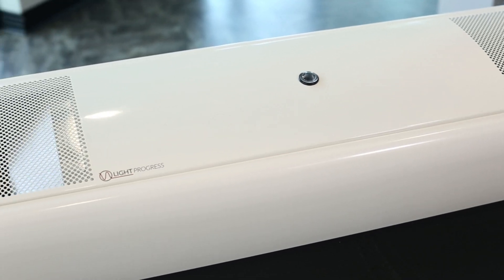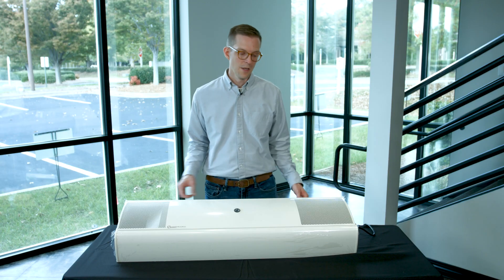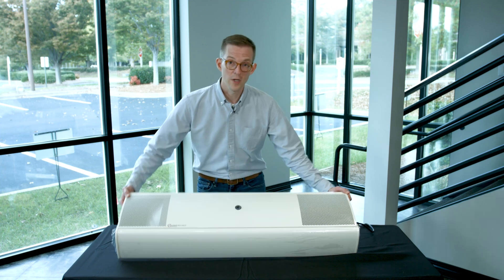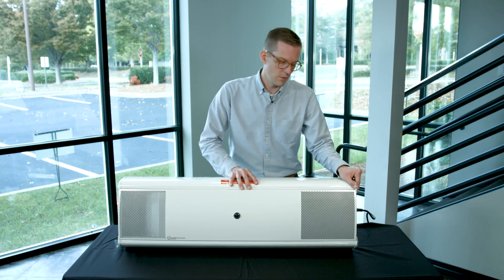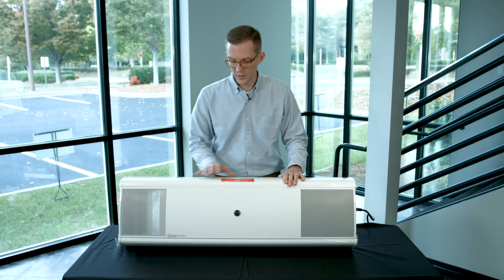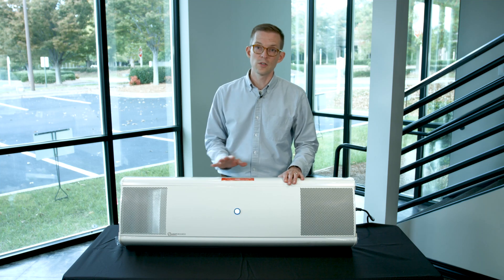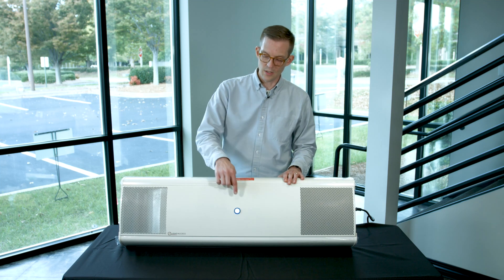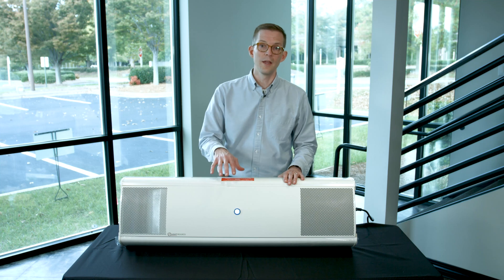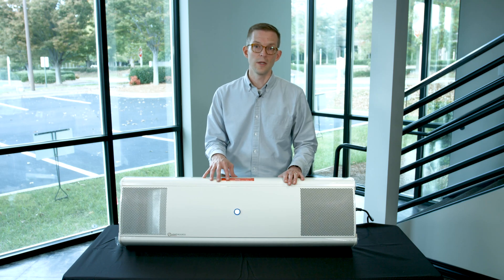At this point we've installed the UV lamps in the center of the unit and plugged it in. I'd like to go ahead and show it to you in operation. I'll pull the unit up so you have a better view and turn on the power switch. When you energize the unit, the fan starts circulating air and you can see the blue light through the sight glass in the center, which gives you an indication that the UV lamps are operating in the center of the unit.